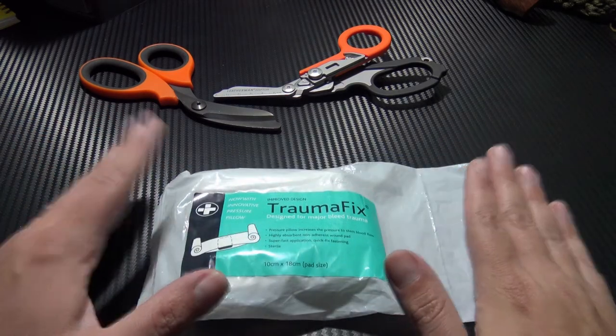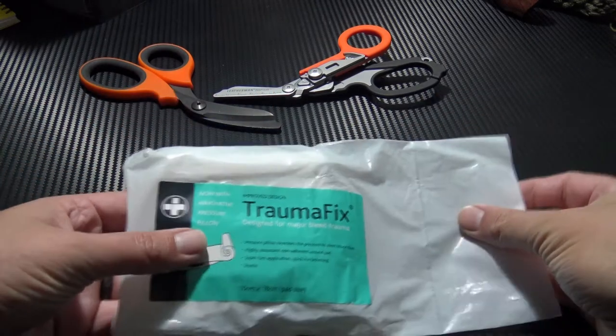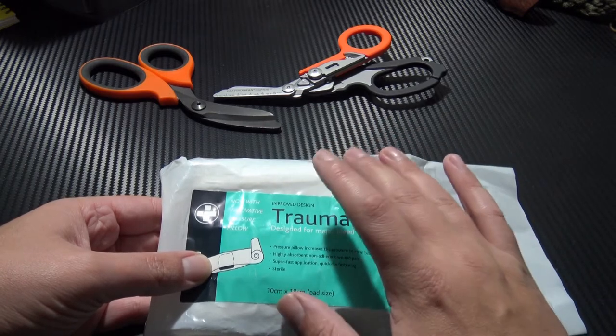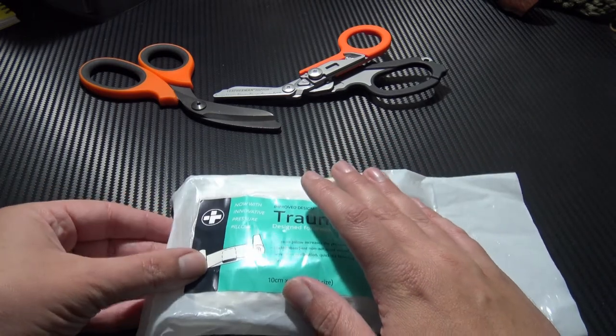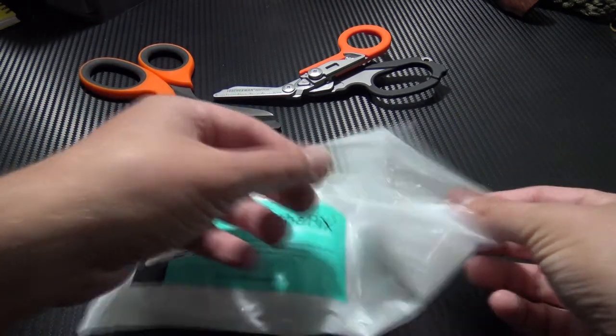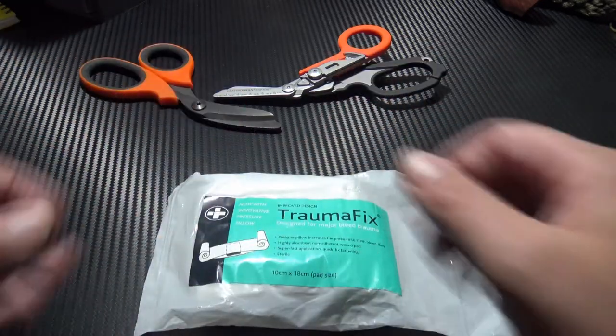We'll take a look at the outside packaging firstly. Here you have the outside packaging. Inside you have the actual wound dressing itself, which is vacuum packed and ready to go. If you wanted to save a little bit of space or time, you can actually remove it from the outside packaging and store it as-is inside, which I'll show you shortly.